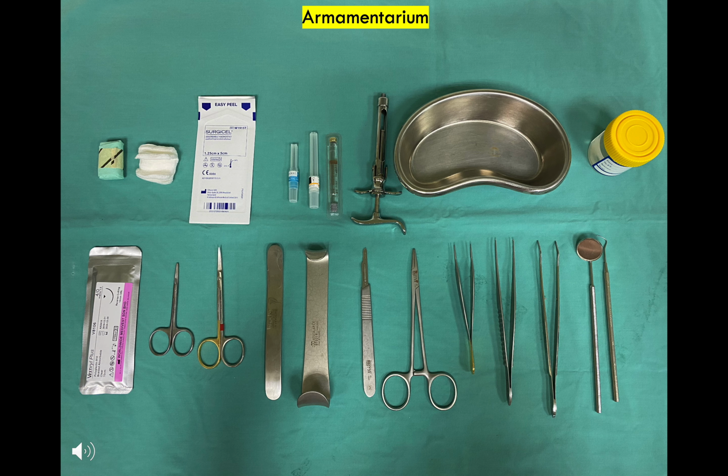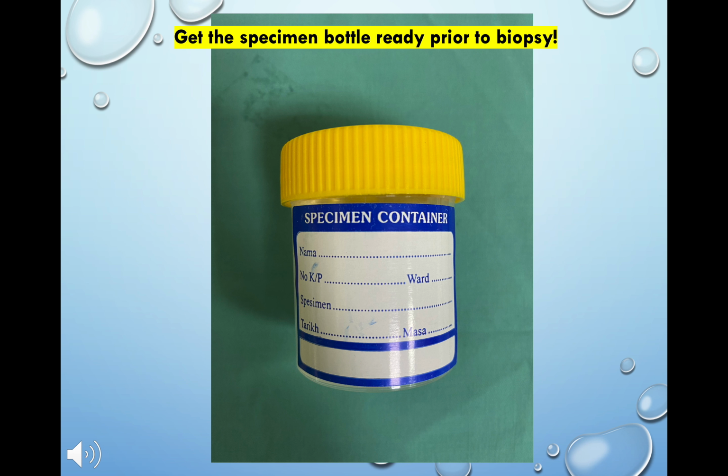These are the basic instruments and materials that we need in a biopsy. First of all, get ready the specimen bottle before the biopsy starts, and make sure patient's details including name, IC number, and also site of biopsy, time of specimen taken, and also date have been filled up prior to biopsy.